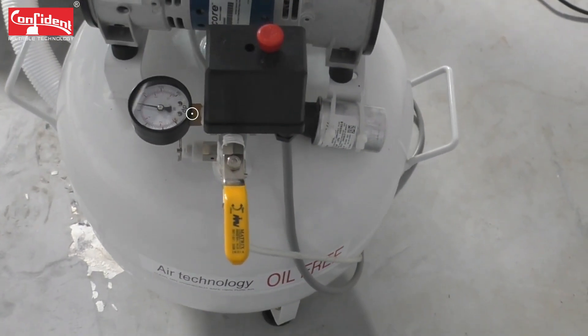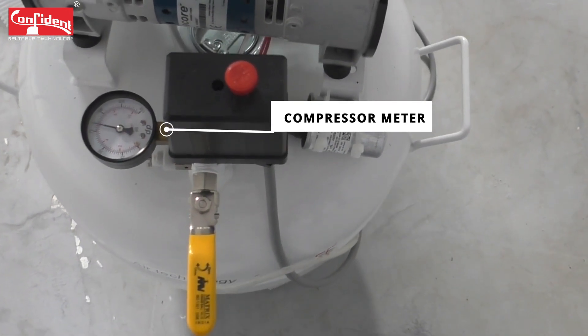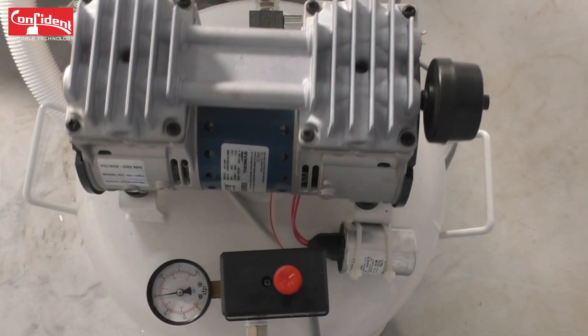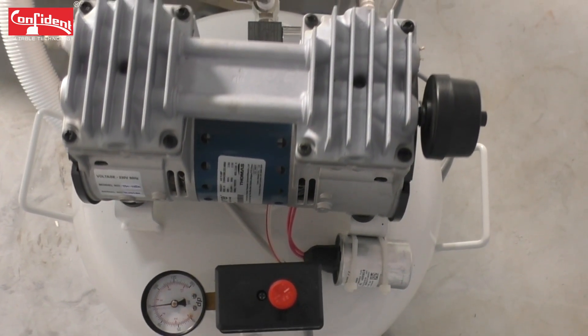In order to increase the air pressure, first you need to check the compressor meter. If there is not enough pressure, turn on the compressor until we get the required reading in the pressure gauge.